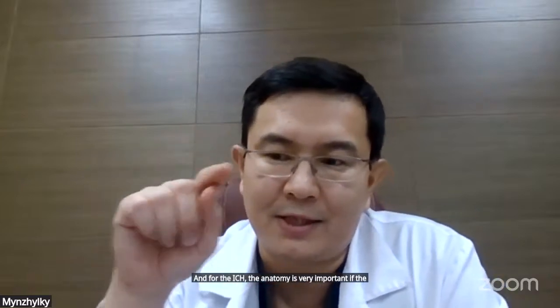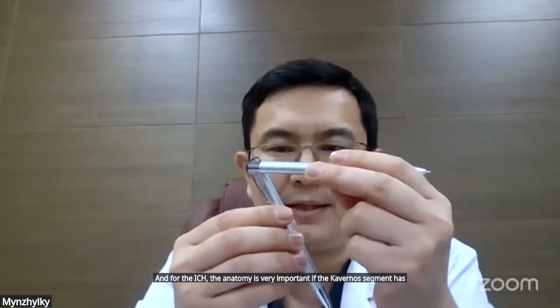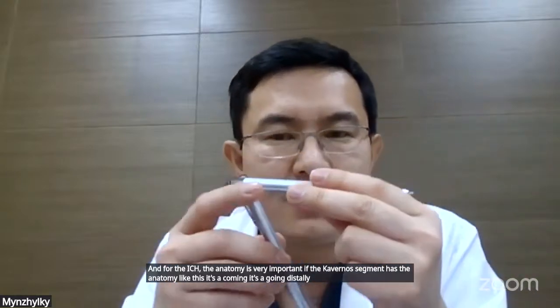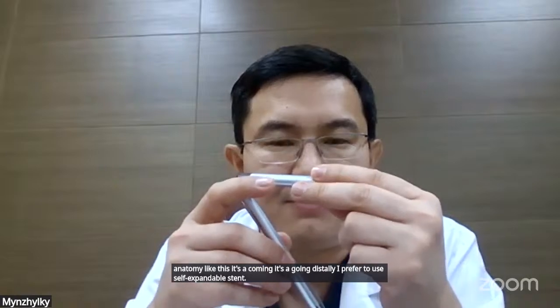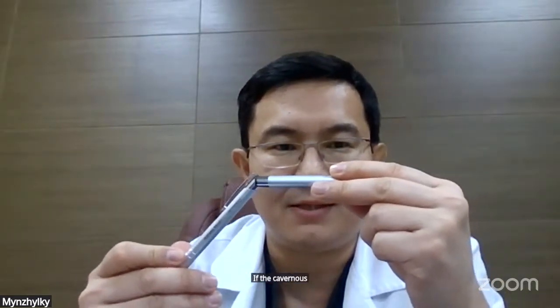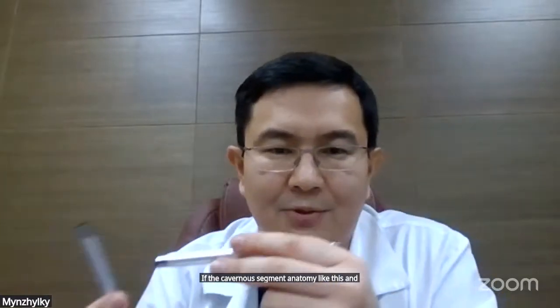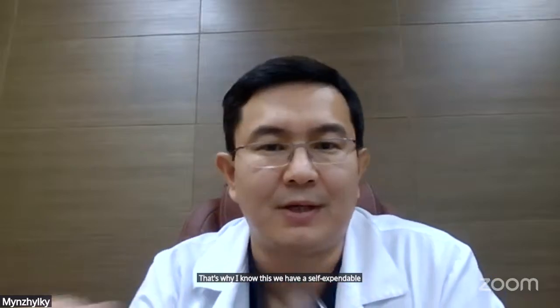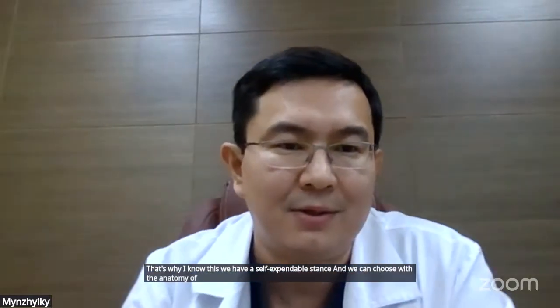If the cavernous segment has an anatomy like this, going distally, I prefer to use a self-expandable stent because this anatomy does not allow me to push the coronary stent. If the cavernous segment anatomy is like this, and the wire and the stent can be sent directly, then it's possible to send the coronary stent without any distal access catheter. That's why nowadays we have self-expandable stents, and we can choose which stent is better according to the anatomy of the cavernous segment.